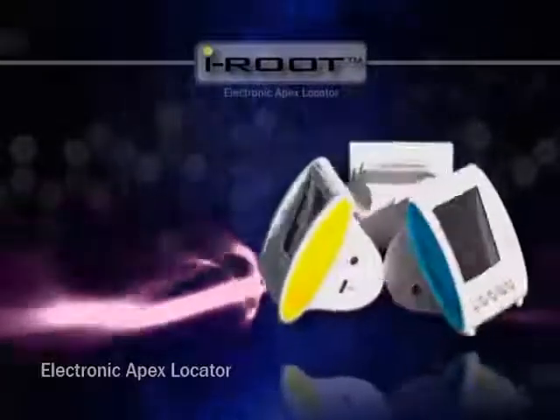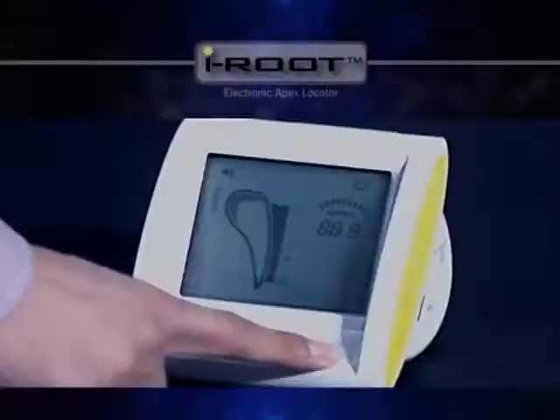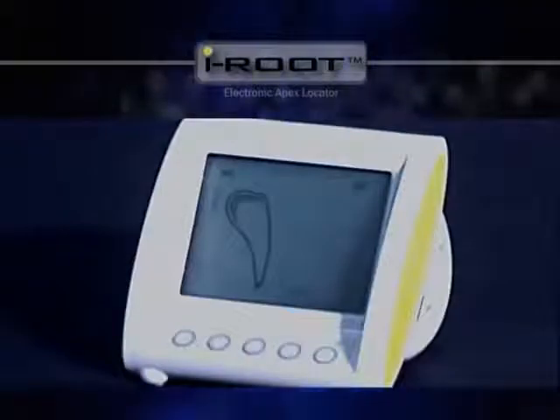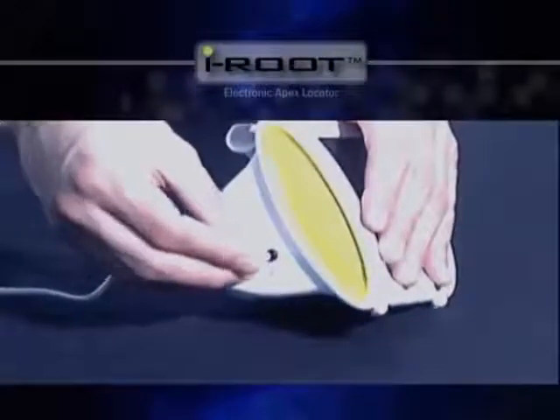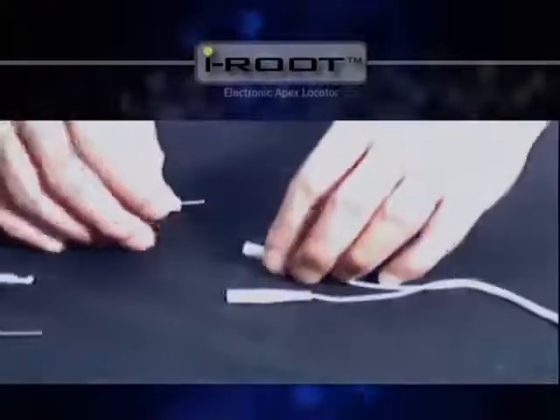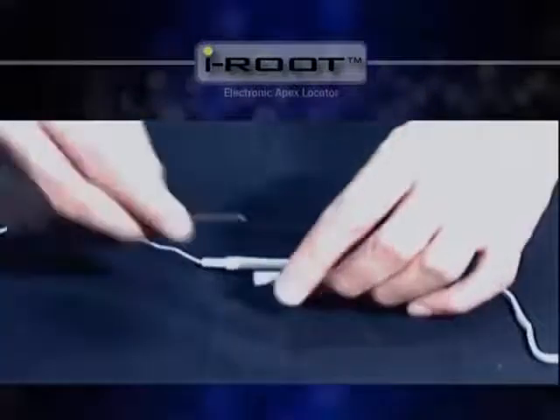Now we'll see what you need to prepare before using iRoot. 1. Check if the LCD screen works fine when the unit is on. 2. Connect the probe cord, and connect a lip clip and a file holder to the 2 ports of the probe cord.